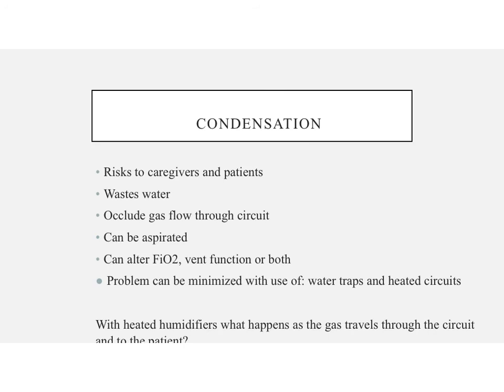So the question says, with heated humidifiers, what happens as the gas travels through the circuit and to the patient? If we have a normal circuit that doesn't have those heated wires, after it leaves the humidifier, that gas is going to start cooling, which is going to decrease vapor capacity, which is going to cause condensation or rainout.